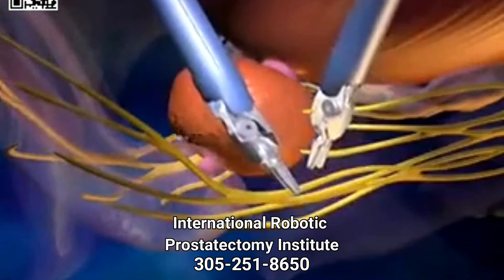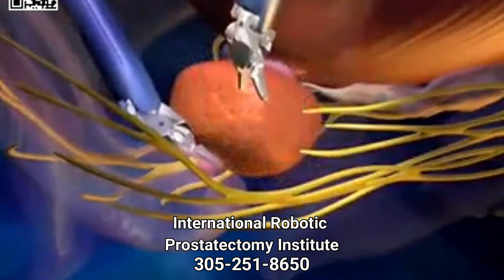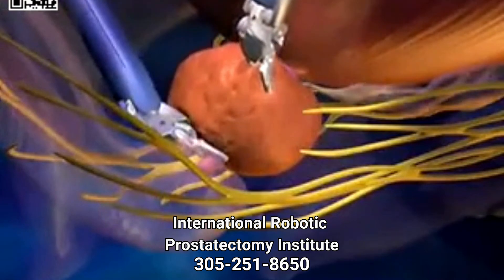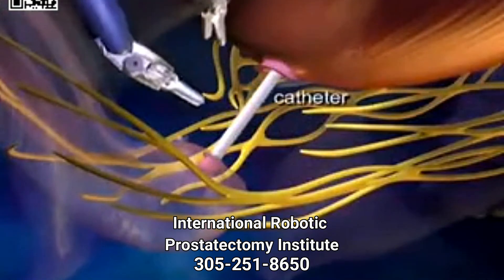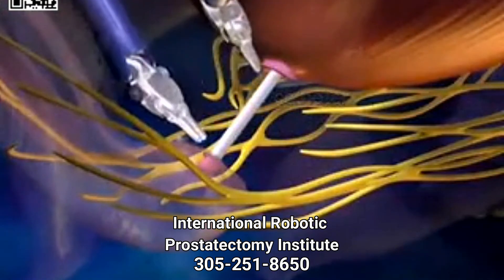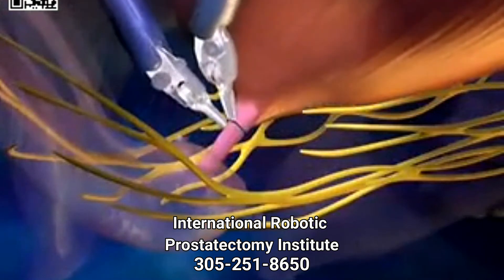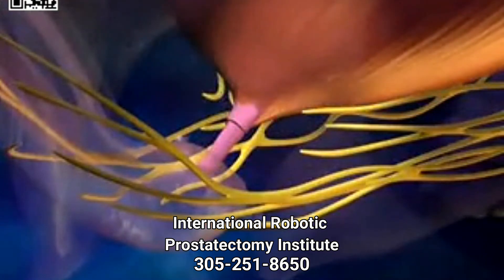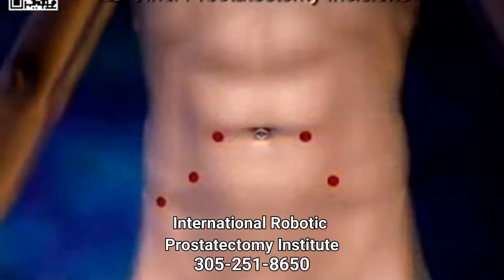Once the prostate is cleanly detached, it is then removed through a small incision. The bladder is reattached to the urine channel over a catheter, which is left in place for a short period of time to ensure proper healing. The surgery is completed with the removal of the instruments and the closure of the small incisions in the abdomen.